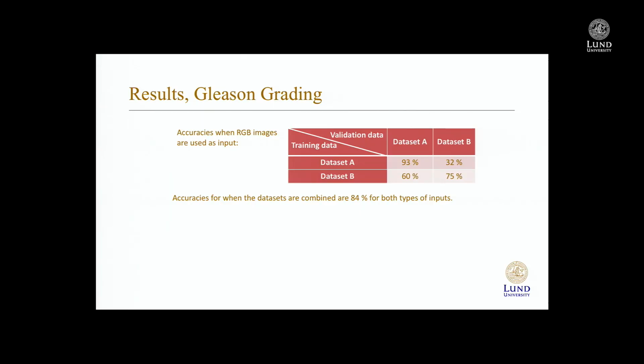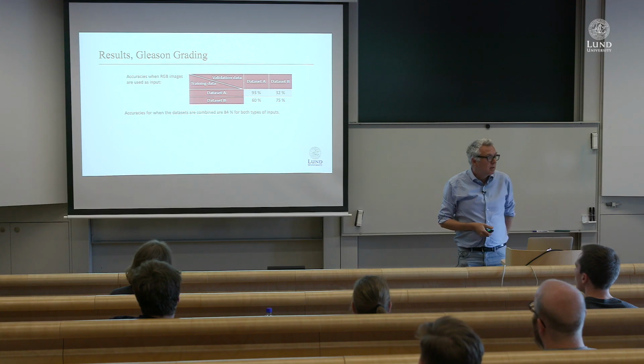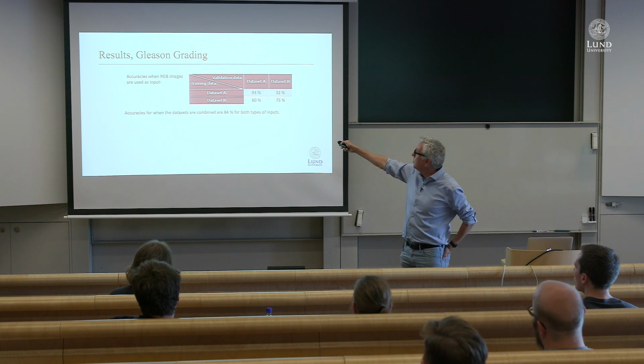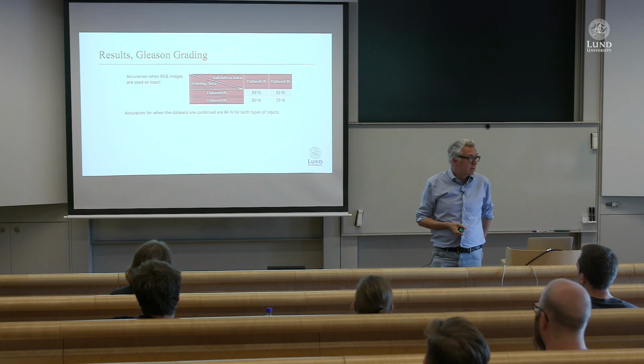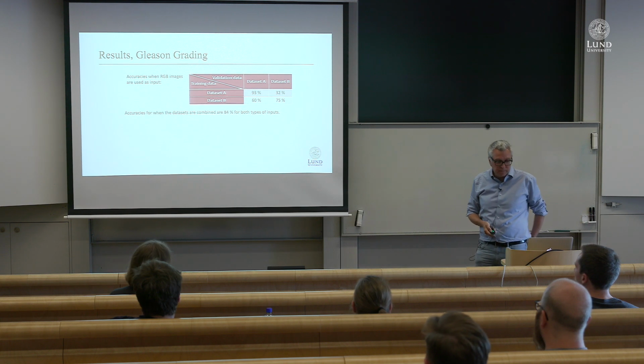hospital, say from a hospital in Dublin that we worked together with. And then when we tried it on images from Lund, it didn't work at all. If we train it on Dublin images and test it in Lund, we get like 32% correct. If we train it on images from Lund, we get 75% correct on the Lund images, but only 60% correct on the Dublin images. So there's something strange going on here.